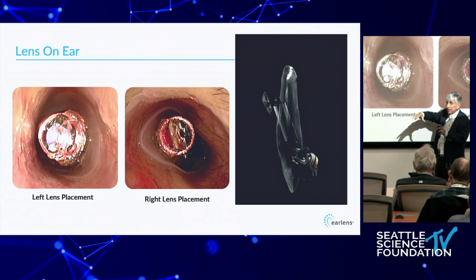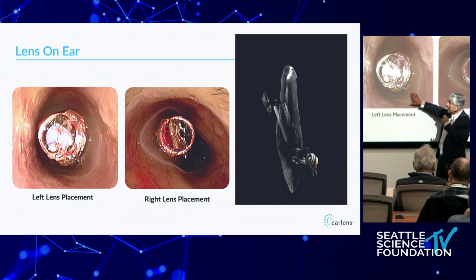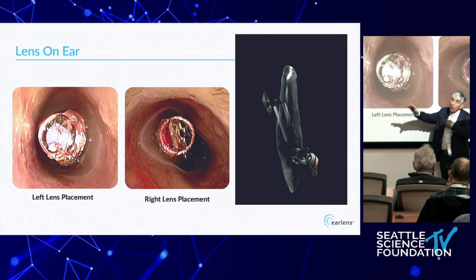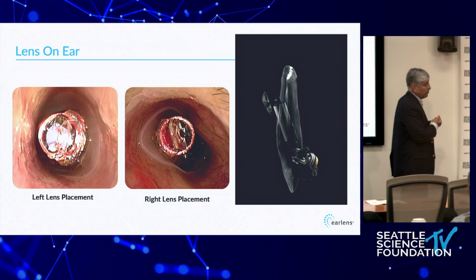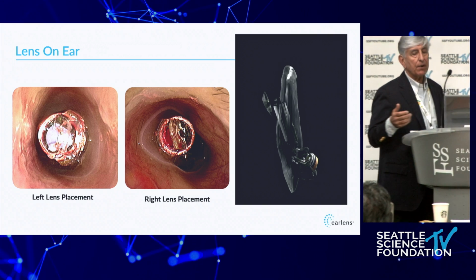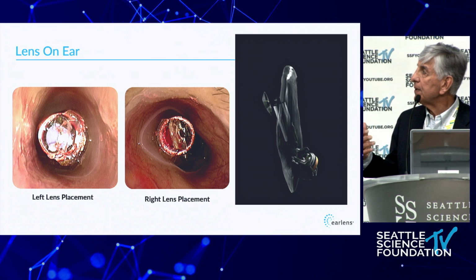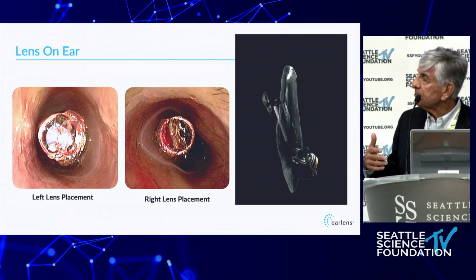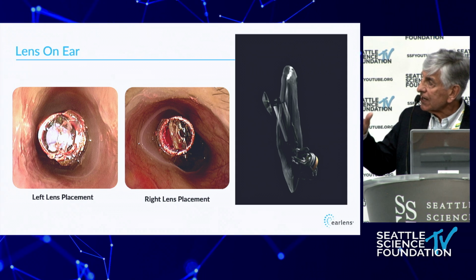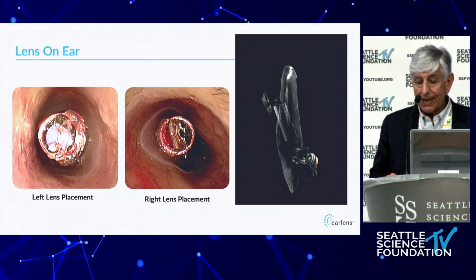And they have to make it perfectly for this to fit for each individual ear. And then patients have to oil that 3 to 5 times a week, depending on each individual. And during this study period, we see patients back every 3 months just because some people will develop a little bit of ceruminous debris or some type of drainage. So we're suctioning excess earwax out and oiling it on a regular basis.